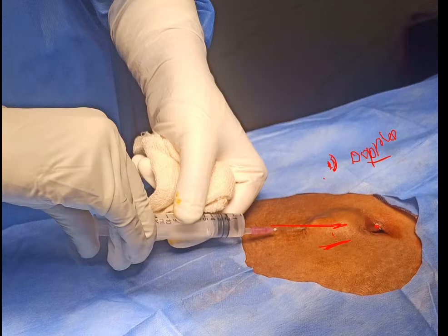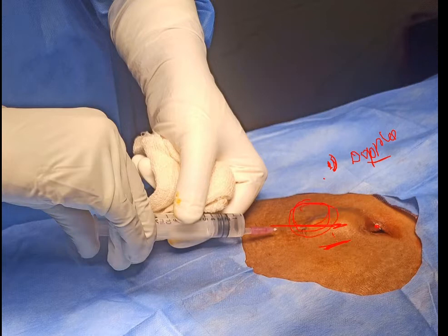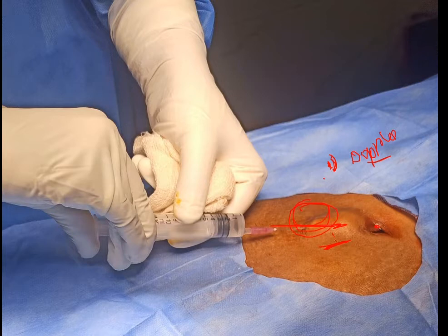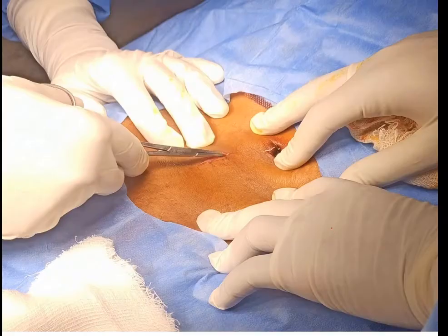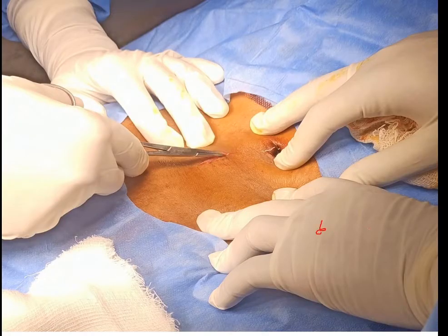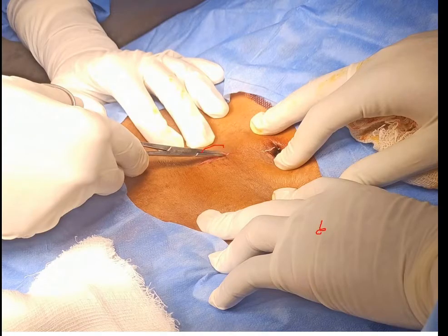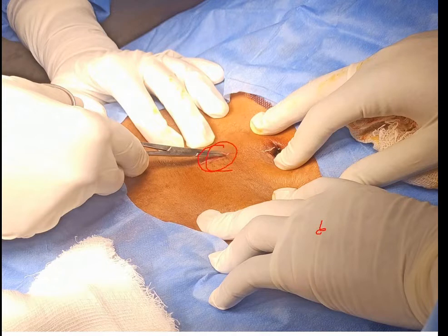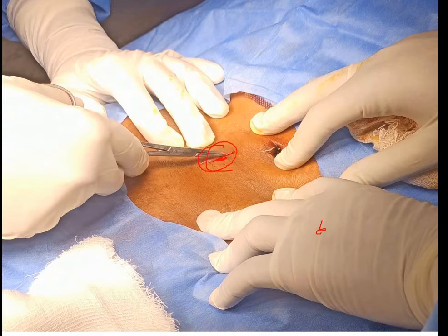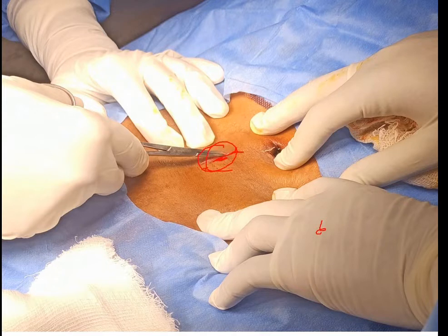A Doppler can be done in the infraumbilical area to look for the presence of blood vessels. First, local anesthesia is given — just at the midline or one centimeter lateral to the midline of the umbilicus. After giving the local anesthesia, the skin incision is made. The incision has to be straight, with no striations, as these increase the chance of infection.